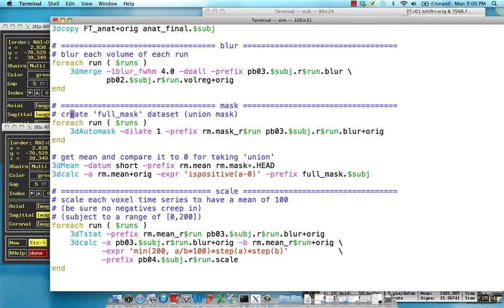In this step, we're going to calculate a mask, which is essentially just ones where we actually want to analyze data and zero everywhere else. You can imagine that we'd want zeros where there's no brain at all, or if there's dead space or air because we're not interested in that. We know there can't be any neural activity in those voxels, but we'd want ones where there's actually signal coming from the brain.